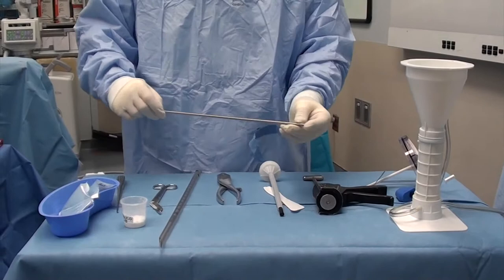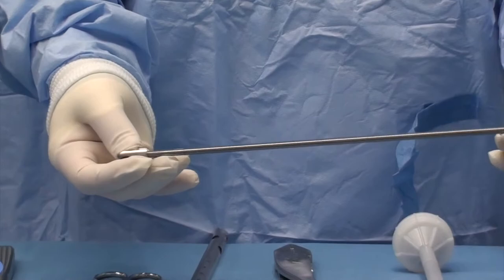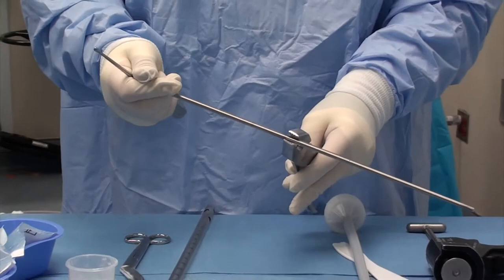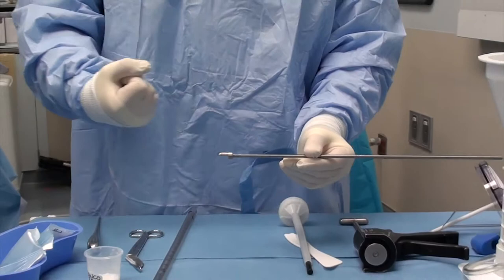This Alizaroff rod is 400 millimeters. You can cut this down to any size that you need with a bolt cutter. What I do is I attach a female hinge to the top part of the Alizaroff rod. I then tighten it on with a pair of pliers so that it can't come off later. The reason for the female hinge will be for later extraction using a bone hook.